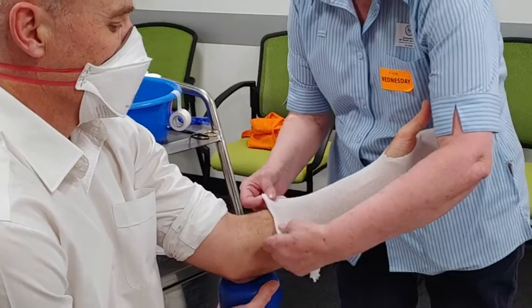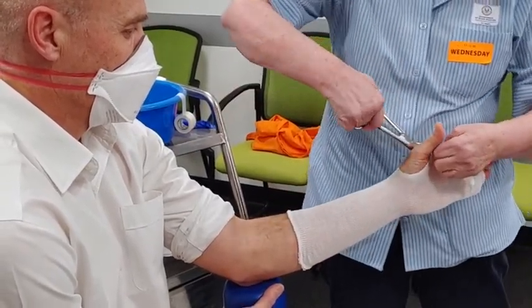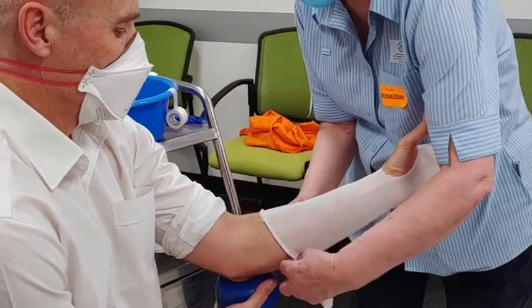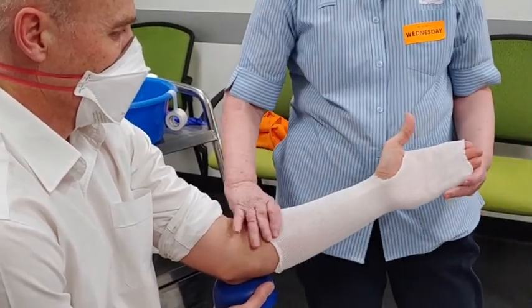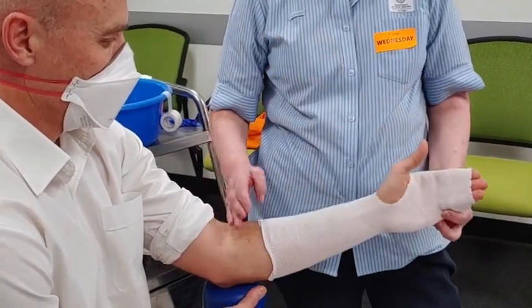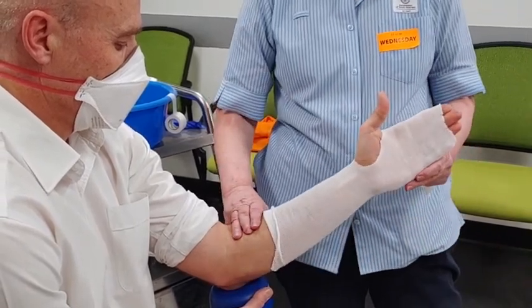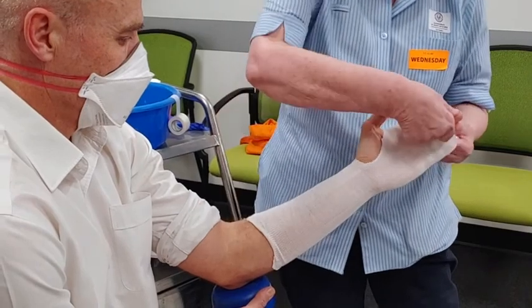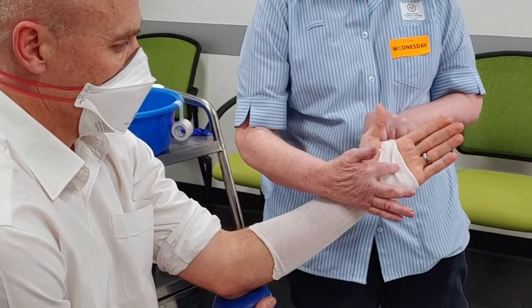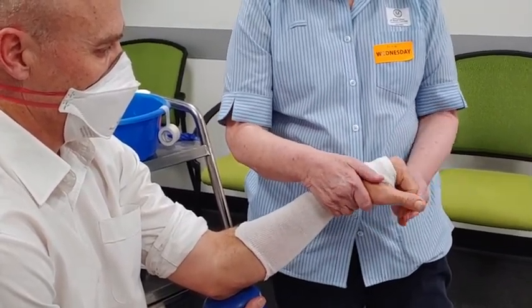Take this and lead it all the way down as far as you need to go. Give that a little more of a split if it's becoming tight. You're looking for about the correct length — you should be able to bend the elbow up and down without the plaster cutting in. This top piece will come down eventually, and that'll be the palmar crease you're looking for. The metacarpal heads need to be free so they can move up and down.